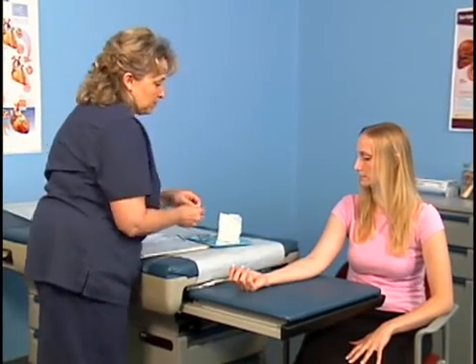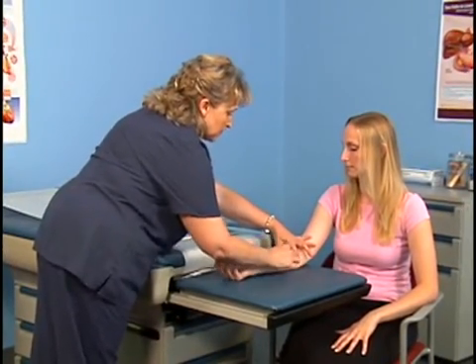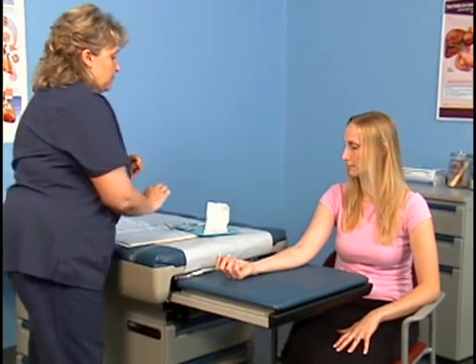Prepare the injection site. Cleanse the area with an antiseptic wipe using a circular motion, starting at the injection site and moving outward. Do not touch the site after cleansing it. Allow the area to dry completely. If the antiseptic is still wet when the skin is punctured, the patient experiences a stinging sensation. In addition, the antiseptic may cause a reaction that could be mistaken for a positive test result.